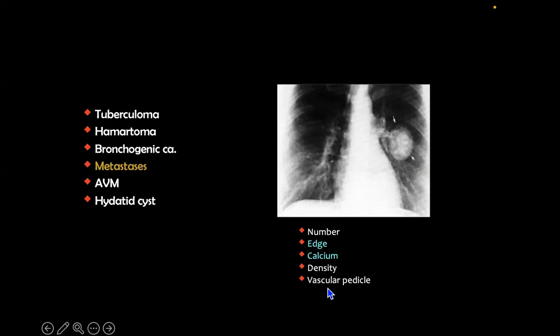Not we look at, we look for these things, and the difference between looking for and looking at is very clear. You look for something, that means you are exerting an effort. You are doing an effort to look for something. But when you look at something, you are doing things passively, just watching the thing. But when you have a look at the chest radiograph, you look for things. You don't look at the things.